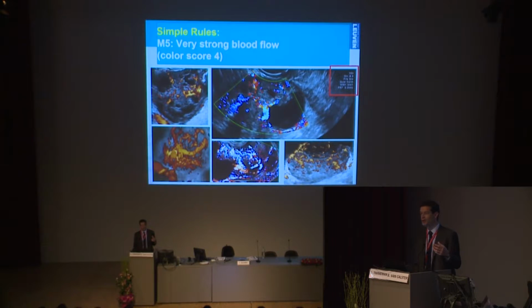That's why we don't like it so much and we try to get rid of it. And in that next image, you don't see blood flow anymore. This is not by accident, it's by choice. Because blood flow is important, and I encourage you to use Doppler in all the tumors that you look at, because sometimes you think this is solid and it's cystic, and vice versa. And color Doppler will help you to distinguish between these two.